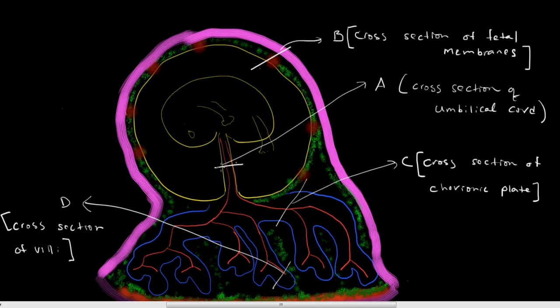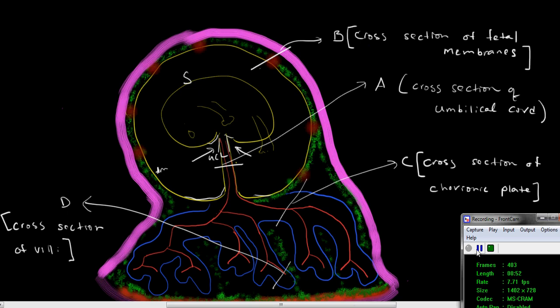In considering the umbilical cord, I want to call your attention to the fact that the lining of the fetal skin is continuous with the lining of the umbilical cord, and then reflects really at the fetal membranes as the amniotic layer of the fetal membranes. So skin, umbilical cord lining, and amnion are all one in essence, except this is a transition zone, a squamo-columnar transition zone, and anyone who looked at a newborn baby's belly button would immediately recall that, yes, there is a squamo-columnar transition zone there.